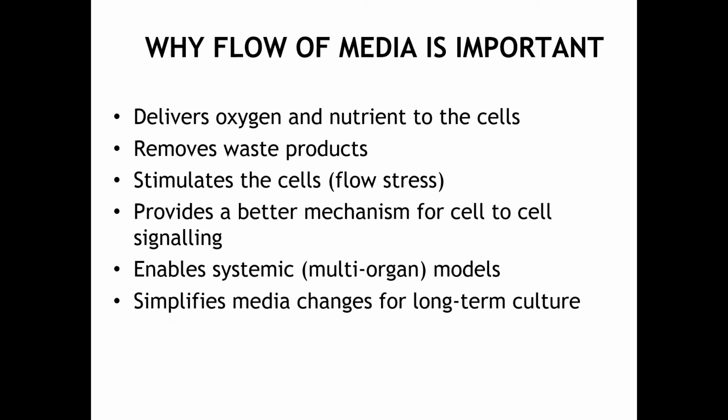So those are the tools, and the idea being that the flow of media has a lot of beneficial effects. It's not only delivering media and oxygen to the cells, it's removing waste products, but strangely, it's the flow of media actually stimulates the cells. And we've got lots of evidence that actually cells are happier under flow than they are under static conditions. And of course, once you've got flow, you can connect together different chambers and look to cell-to-cell or tissue-to-tissue signaling, and you move towards multi-organ models.